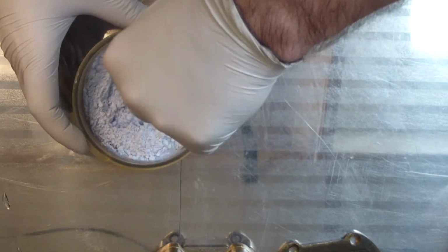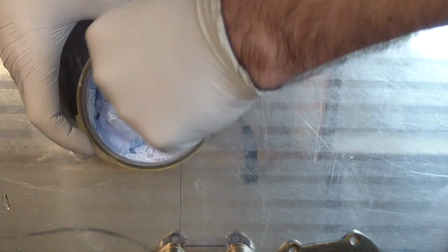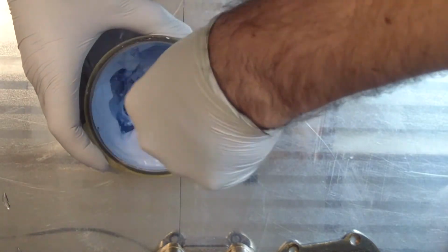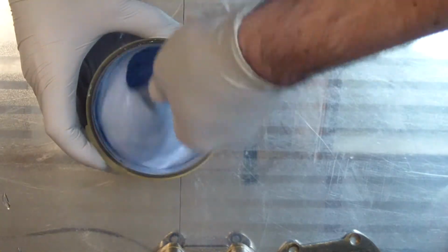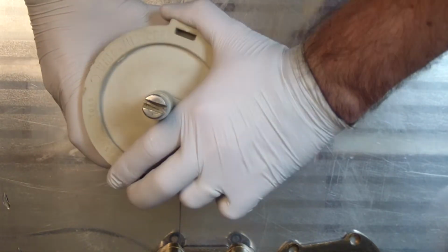Not too slowly because you don't want to have things set up on you if you're taking 10 minutes to mix your stone. So just make sure everything is thoroughly mixed. Everything is nice and incorporated. What I'll do now is I'll take my cover, place it on the container, and I will vacuum mix it. It's going to be out of the frame a little bit, but most of you guys know what a vacuum mixer looks like and how it works, so that shouldn't be an issue.